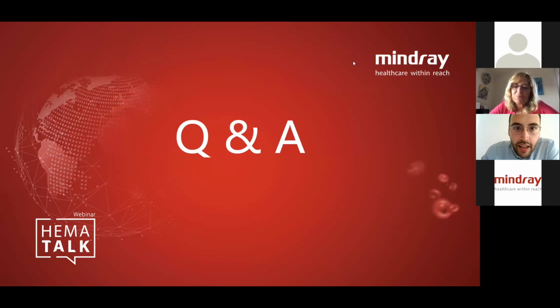He says, in adults over 45 years old, which level of lymphocytes do you recommend to provoke a smear review? I recommend when this number is more than 4.5 x 10^9/L. 4.5 x 10^9/L, I think, is the sign to review the smear. Okay. He says thank you. Thank you to you.